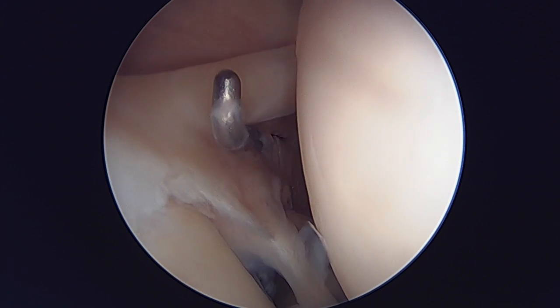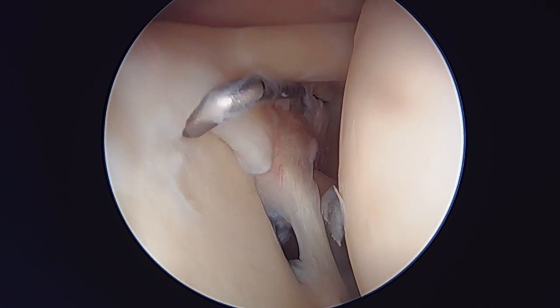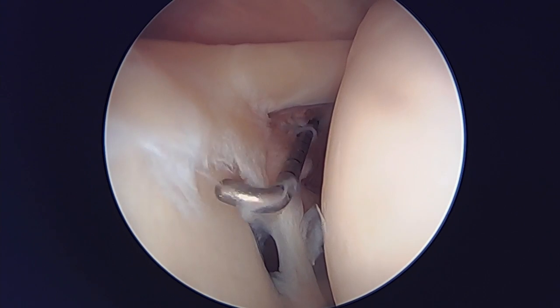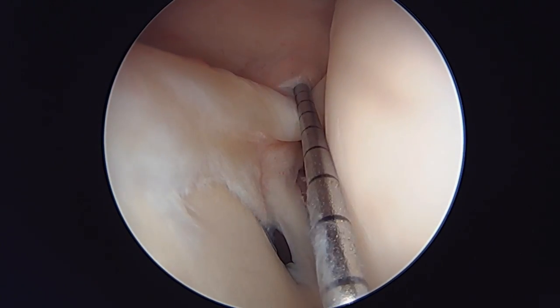Right above my probe here you can see the biceps tendon. To my left is the superior labrum, extending anterior all the way back posterior. SLAP stands for superior labrum anterior to posterior. You can see the long head of the biceps coming in here and attaching to the superior labrum.